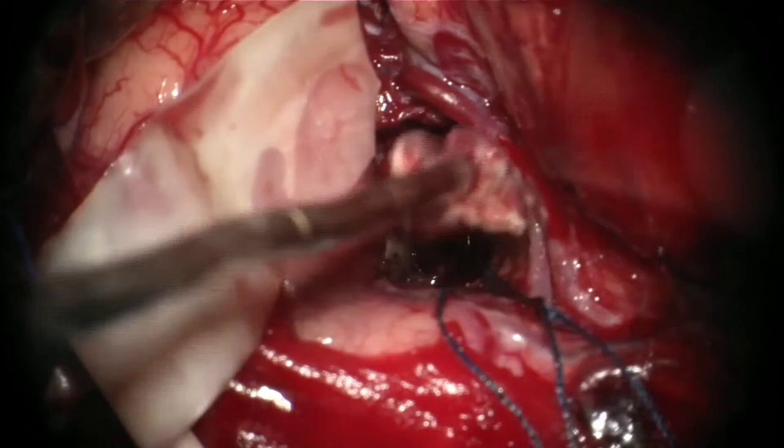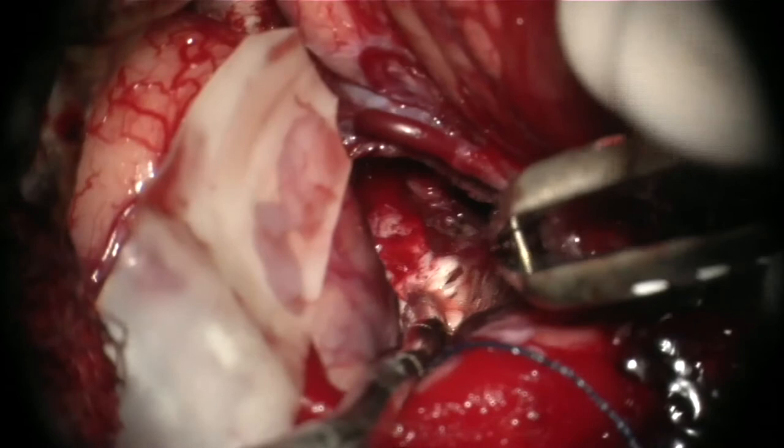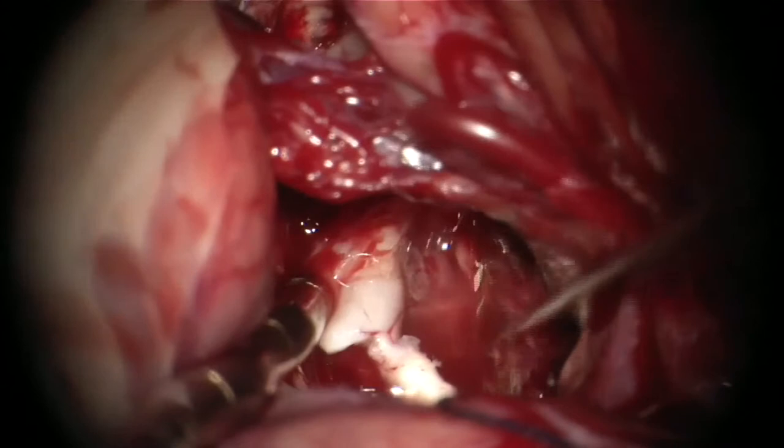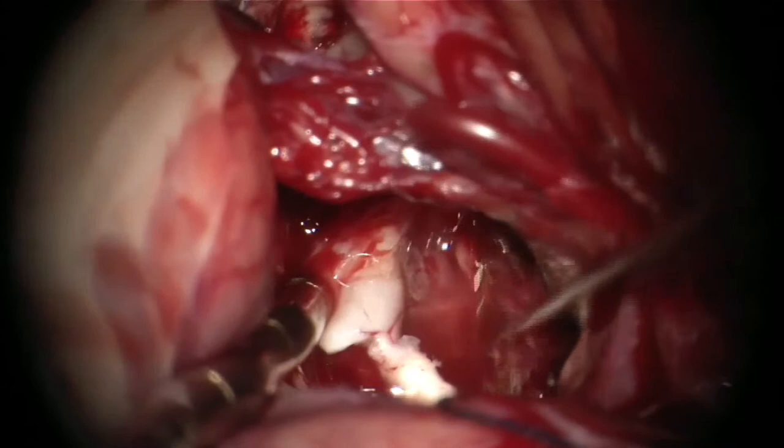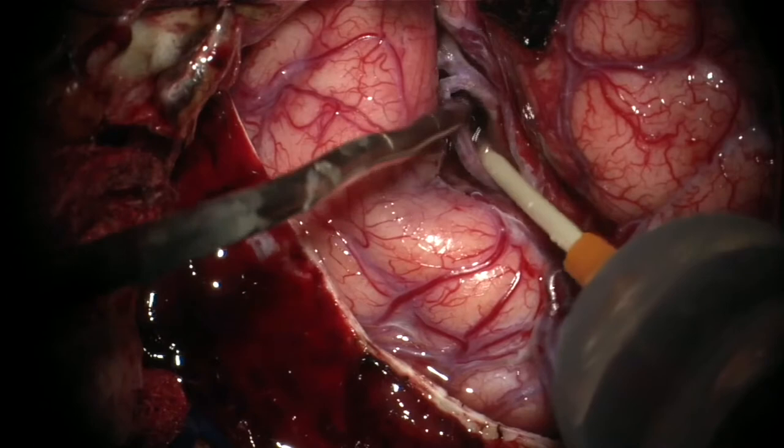I see the inferior ventricular vein running into the basal vein. And I can see part of the fimbria. And I open the choroidal fissure. And I finally disconnect the fimbria from the body of the hippocampus to the head of the hippocampus. And I remove the last pieces of the hippocampal head in a subpial fashion, leaving that pial-arachnoid plane to protect the choroidal artery, the PCA, and all the cisternal structures. And this is at the end of the resection.